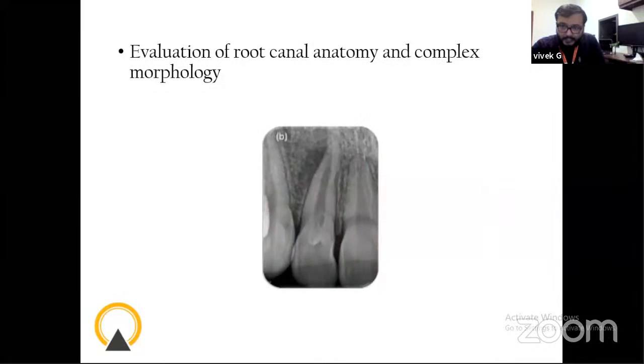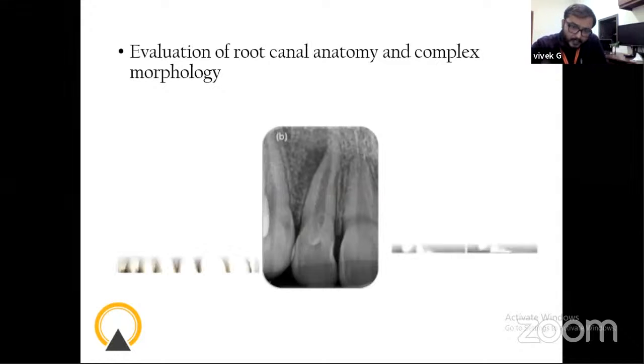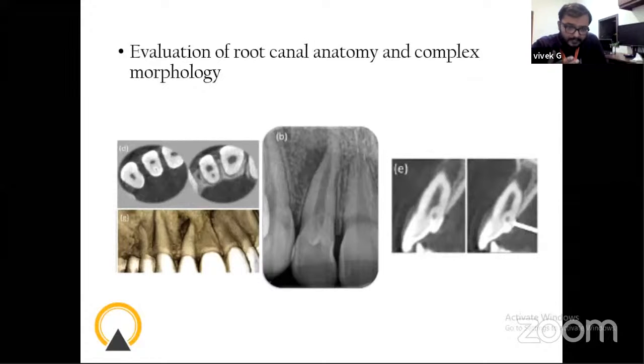And when an intraoral periapical radiograph of the same patient was taken, I hope all can see a radiolucency on the distal, middle and apical third of the lateral incisor. Is there anything else that is visible in the intraoral periapical radiograph? The lingual groove can be seen again. But now, when we take a three-dimensional radiograph like a CBCT, the third dimension will help you see, in the axial sections marked D, a radiolucency, which is the pulp chamber, and then a radiopacity surrounding a radiolucency just palatal to it.